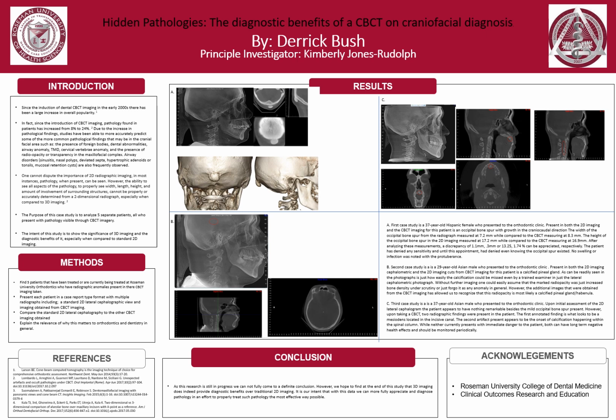Basically, we're going to present each patient in a case report type format with multiple radiographs, including a standard two-dimensional lateral cephalographic view, and then a CBCT imaging or cuts from a CBCT image. And then basically we will compare the two, see if there's any discrepancy between the two, and then explain the relevance of why this matters in orthodontics and then just general dentistry.